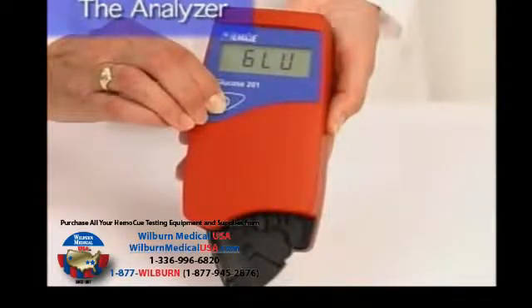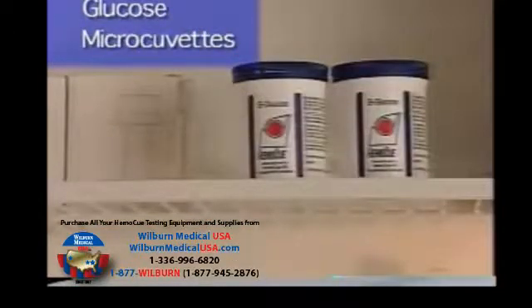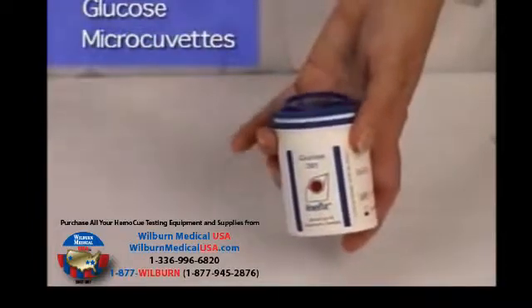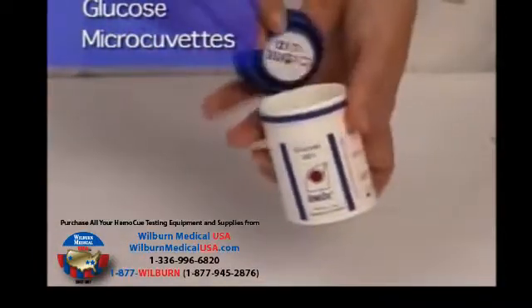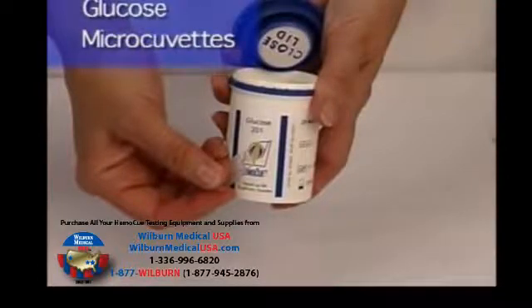The system is factory calibrated and needs no further calibration. The HemaQ glucose reference system is traceable to an isotope dilution gas chromatography mass spectrometry method, or ID-GCMS. The HemaQ Glucose 201 microcuvettes contain an exact quantity of dried reagents, which automatically produce a chemical reaction when in contact with blood. The microcuvettes should be stored refrigerated. A sealed, unopened vial of microcuvettes has an expiration date of 9 months from the date of manufacture, as indicated on each vial. Once opened, the vial will have an expiration date of 30 days. It is recommended that the date of opening be written on the vial for good laboratory practice.